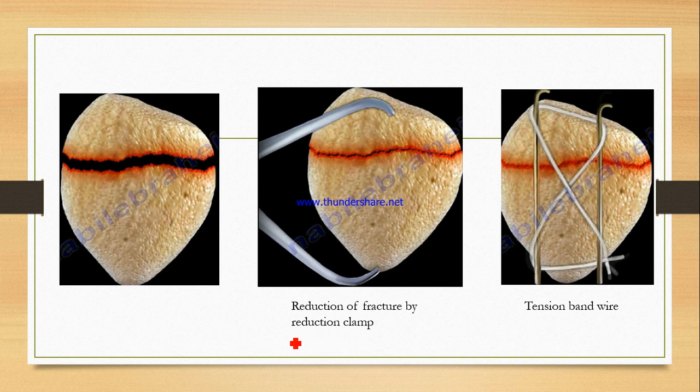Using some reduction clamp, the reduction of the fracture will be done. After that, this is a very commonly used technique. K wire, these pins are called K wire.